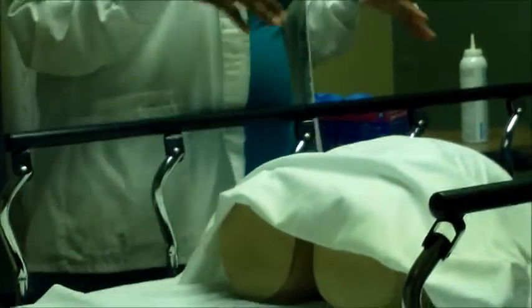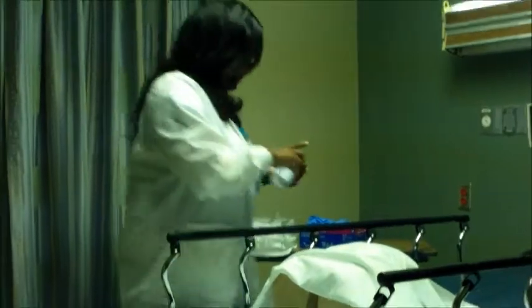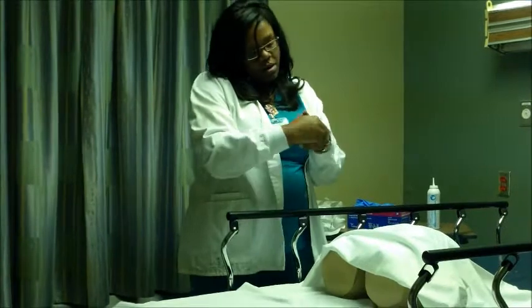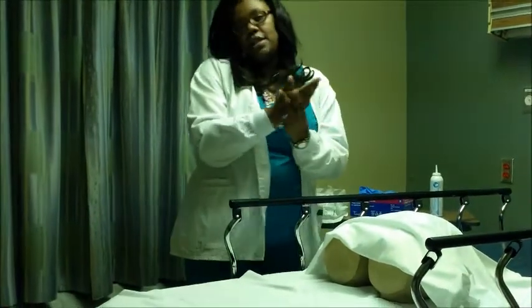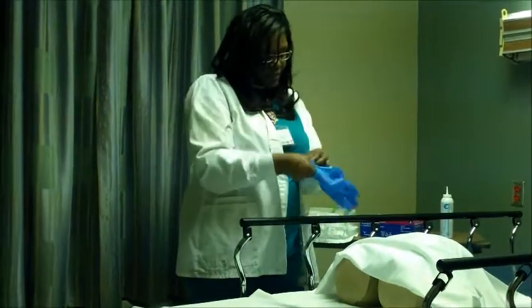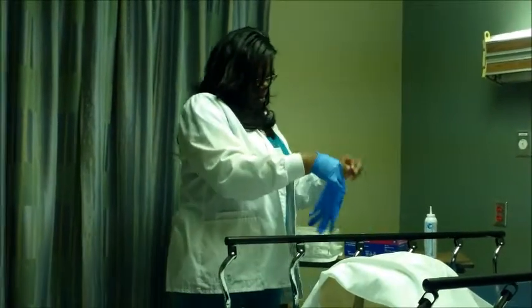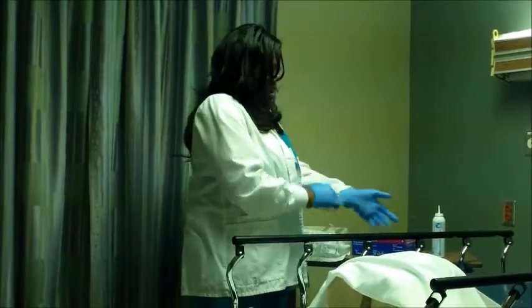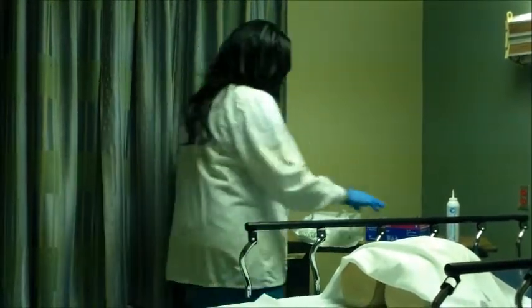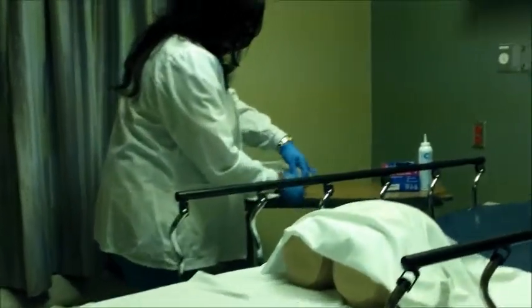In substitution of washing my hands, I'm going to use hand sanitizer. Make sure that you use proper hand hygiene. I'm going to rub my hands until they're dry, and I'm going to don a pair of clean gloves. At the bedside, I have a Foley catheter kit. Now, I want to open up my package. I want to make sure that this is the only area that I'm going to utilize for this procedure.